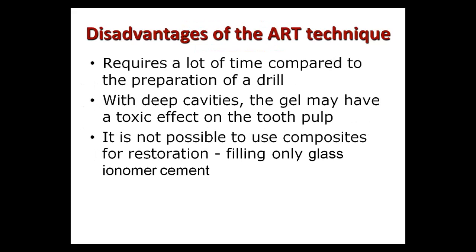And of course this method has some disadvantages. It requires a lot of time compared to preparation with a drill. With deep cavities, the gel may have a toxic effect on the tooth pulp, and it is not possible to use composites for restoration because the filling is only glass ionomer cement.